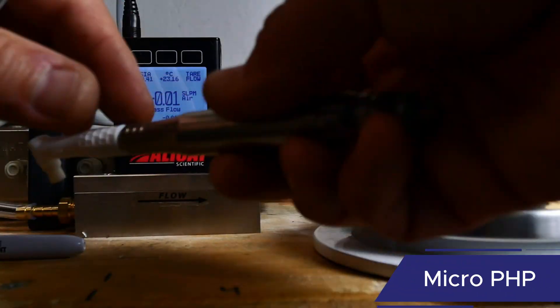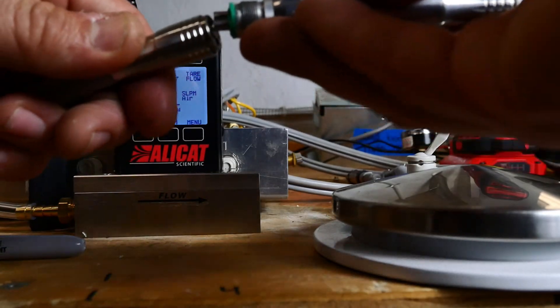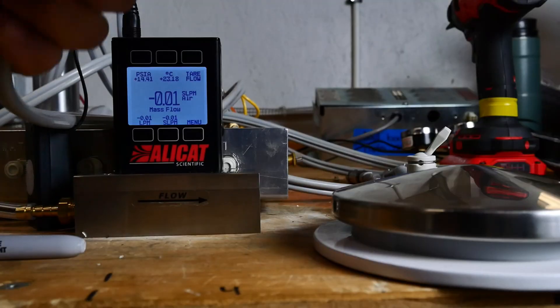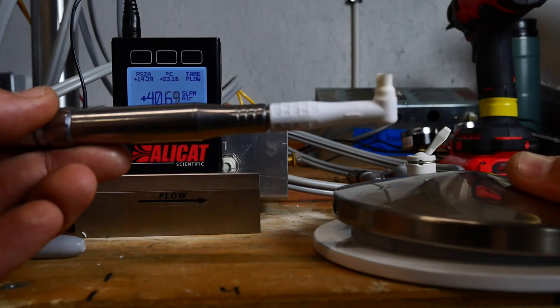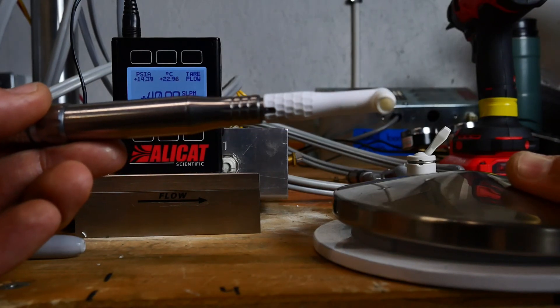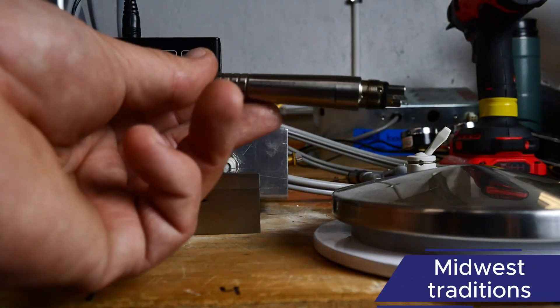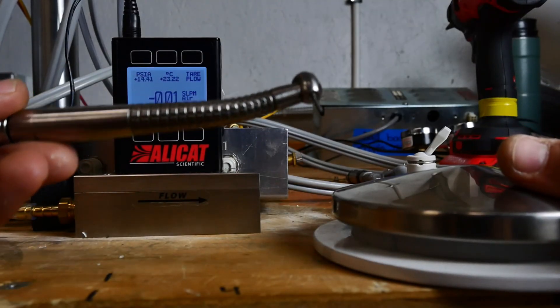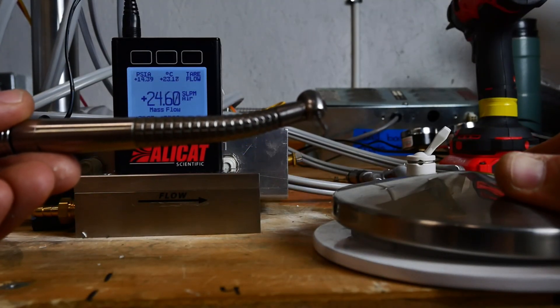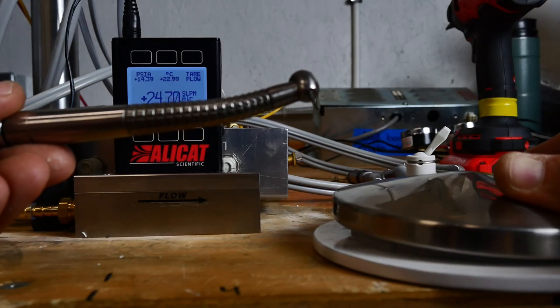Next is a Micro PHP. That's also 40 standard liters per minute. Now we'll start doing some high-speed hand pieces. First up is the Midwest Traditions, which reads about 24 standard liters per minute.